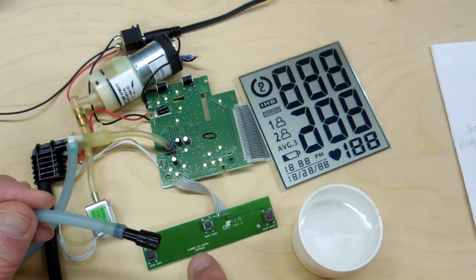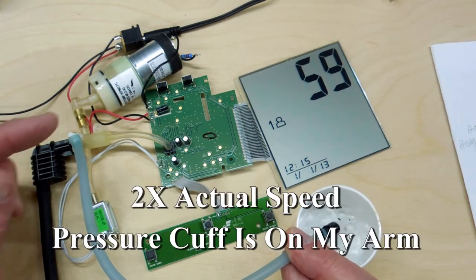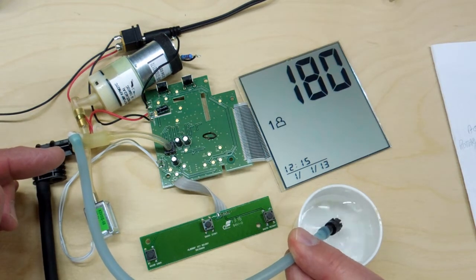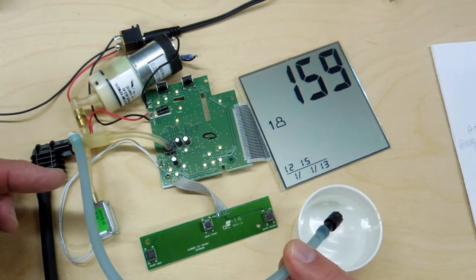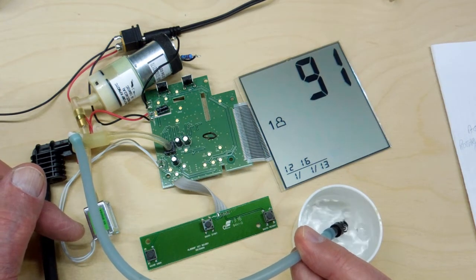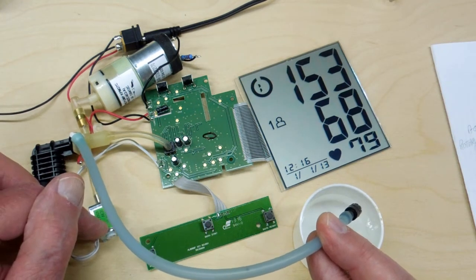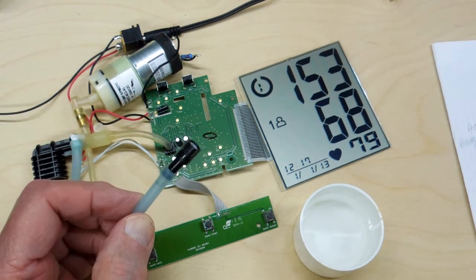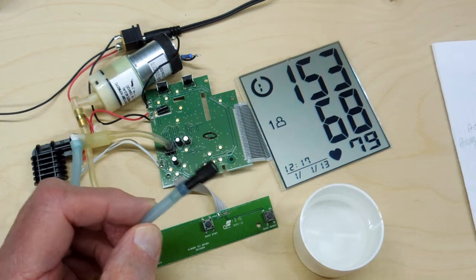Now I'm going to turn this on and we're going to see how this works. The pump is delivering air fast enough to inflate the cuff and overcome any loss through the bleed orifice. Now it's deflating the cuff at an even rate until the test is done. Then the solenoid valve opened at the end of the test and released all remaining pressure in the cuff.